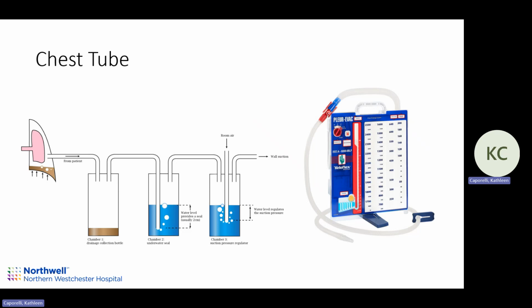The newer ones, like the ones that we have here, we call it a dry system, so you don't actually see that bubbling anymore. But in the old ones, any of you guys remember the old ones that would bubble? Yeah, okay, good. So you would see it bubbling. That was a normal thing, and that's how it was. The newer ones don't have that.